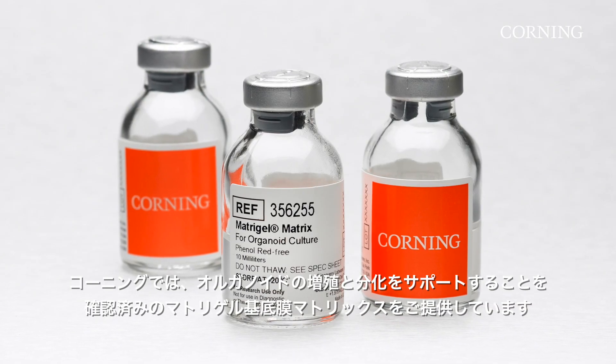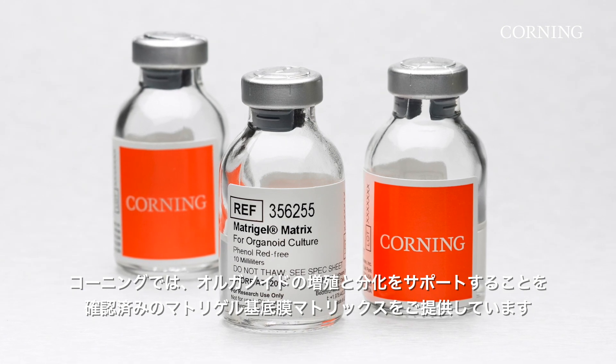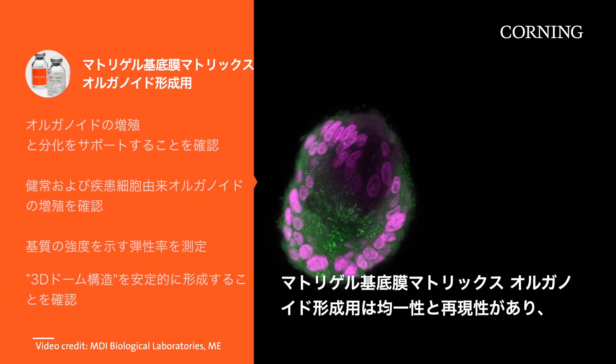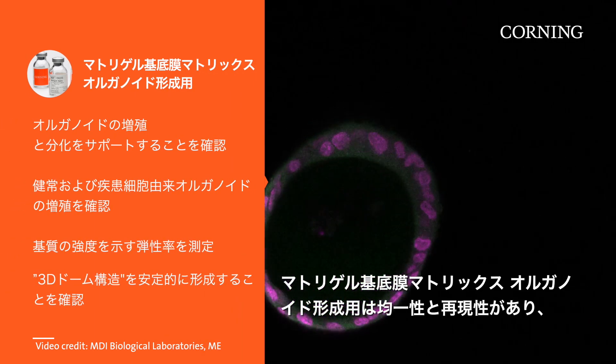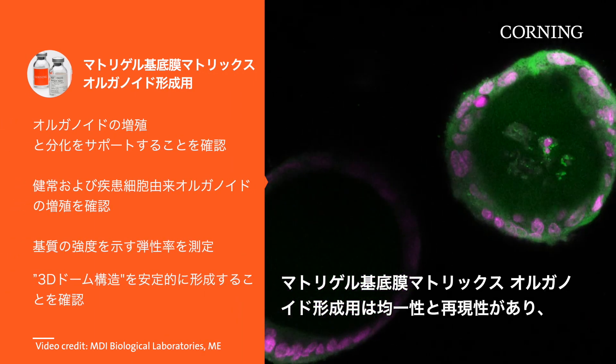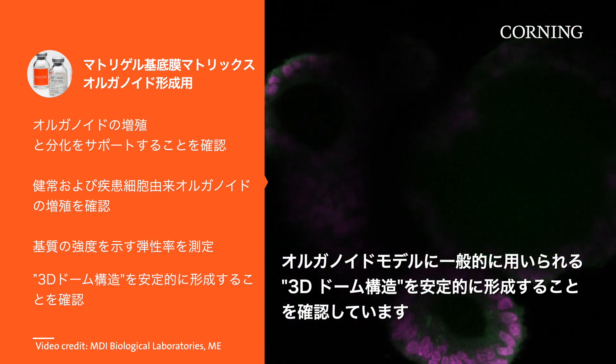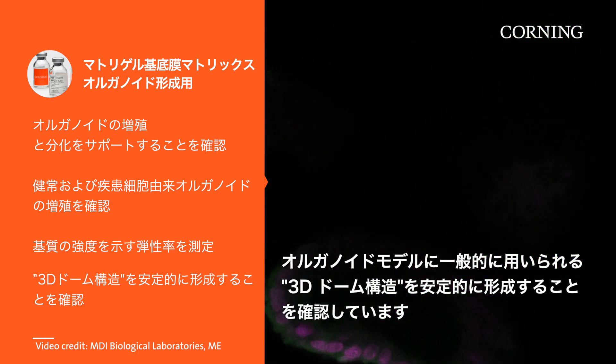Corning offers an optimized Matrigel Matrix that has been verified to support organoid growth and differentiation. Matrigel Matrix for organoid culture provides consistency and reliability and is qualified to form stable 3D dome structures commonly used in organoid models.